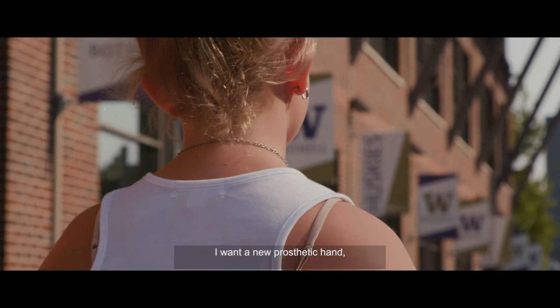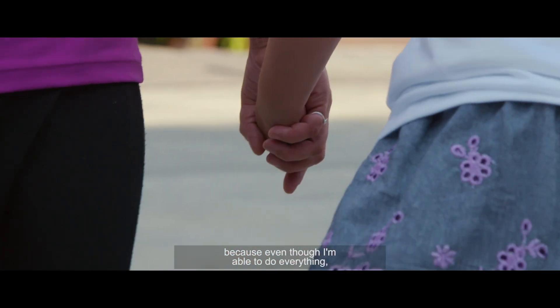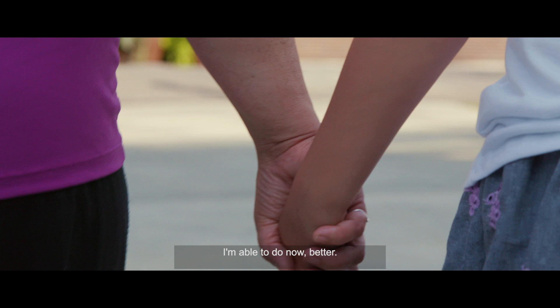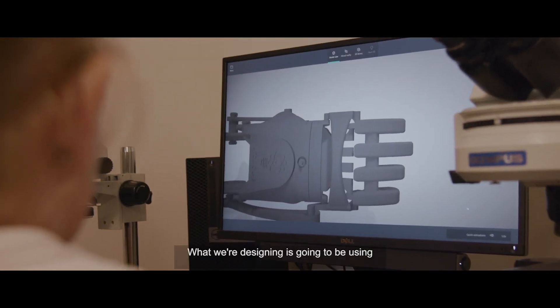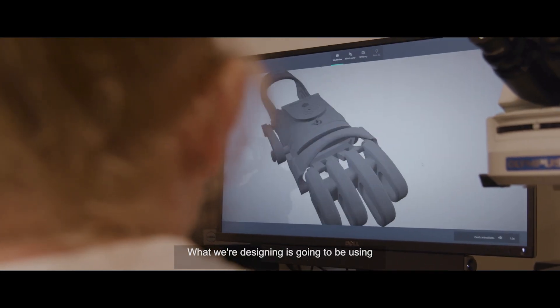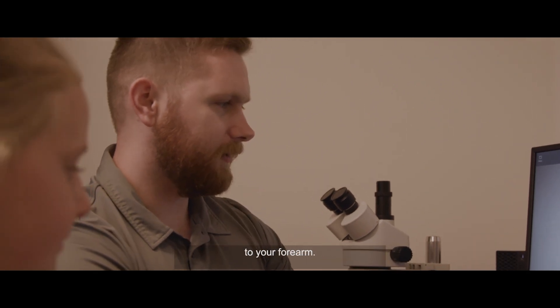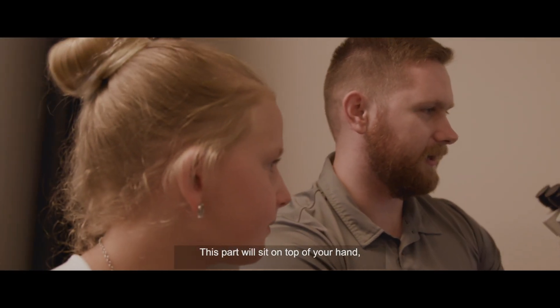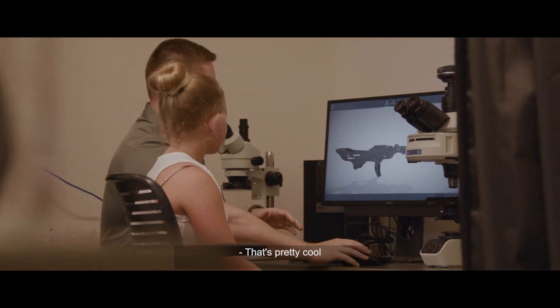I want a new prosthetic hand because even though I'm able to do everything, I'll be able to do some of the things I'm able to do now even better. This is an open-source prosthetic. What we're designing is going to use a lot of this same functionality — it will attach to your forearm, sit on top of your hand, and we're going to put a strap on it to secure it to you. That's pretty cool.